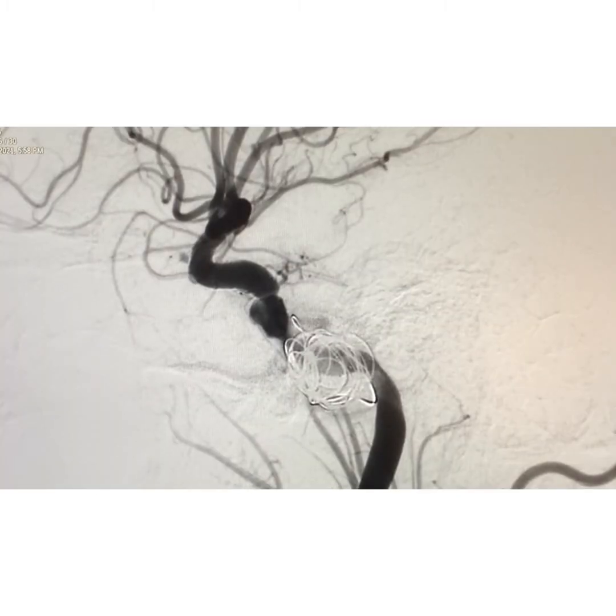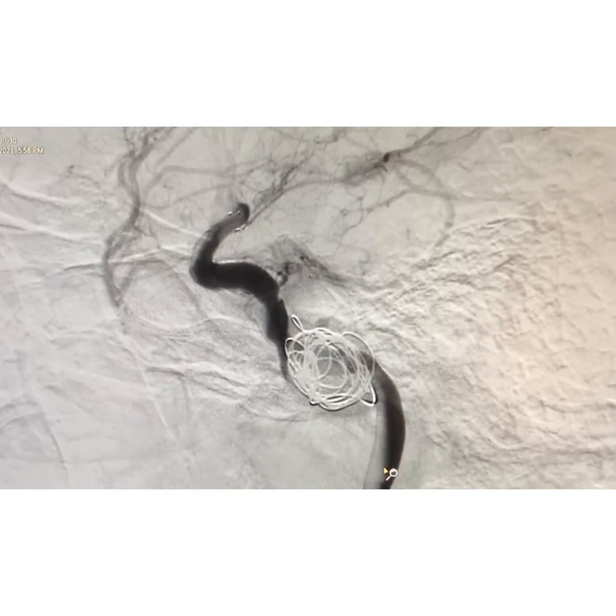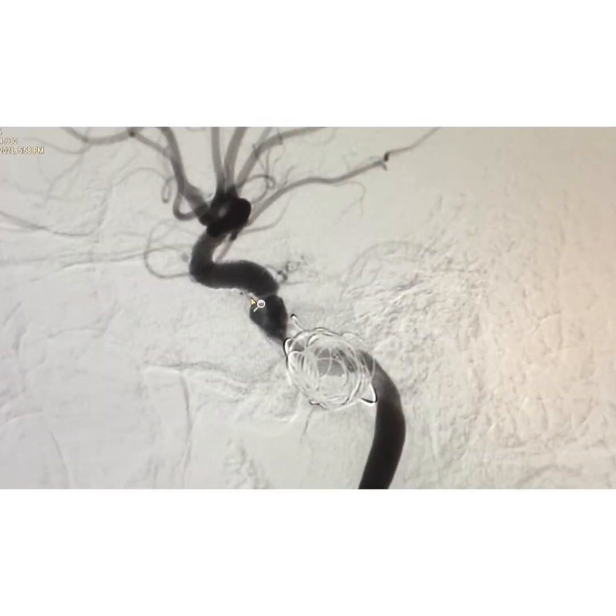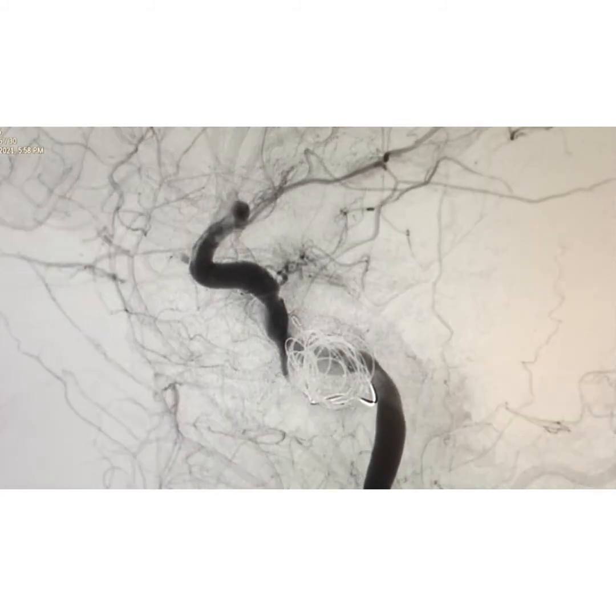And now we can see the angiogram, which is looking beautiful. So you have the internal carotid artery going, and this is the part of the aneurysm which is very stagnant. This is the main part of the aneurysm. It's very stagnant now, and you can see the internal carotid artery which is taking a beautiful shape up, and the intracranial circulation looks perfectly all right.